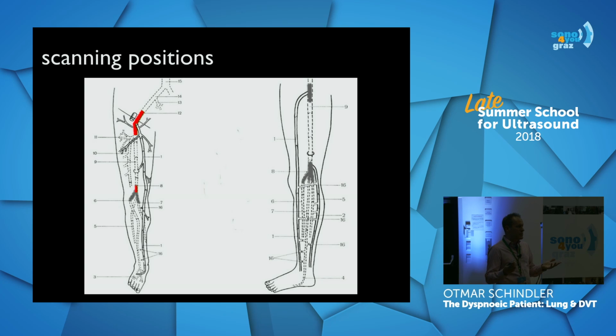And the third thing is, if we think there is pulmonary embolism and everything fits into the clinical picture, we just look for the vein, for the thrombosis that's causing the pulmonary embolism. And if we find it, we are sure. If we don't find it, well, that's a problem. But it's still the same thing. We just try to rule it in. If we have it, we can be sure that the thrombosis is there.